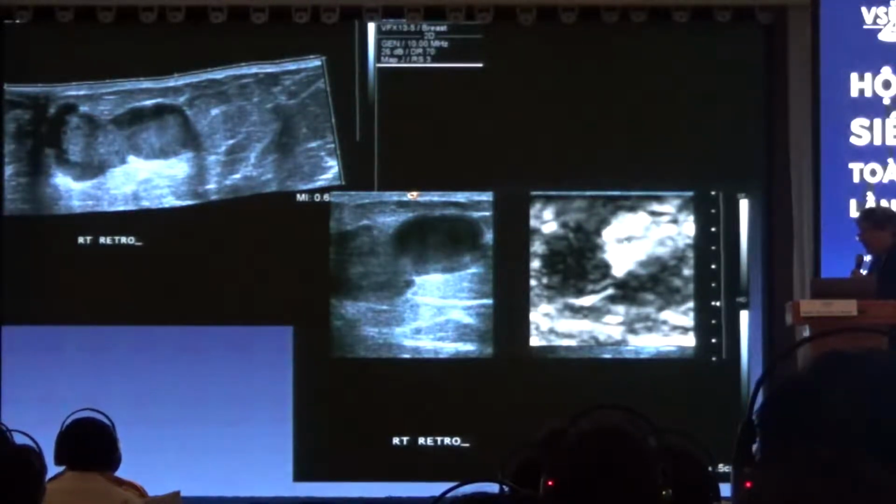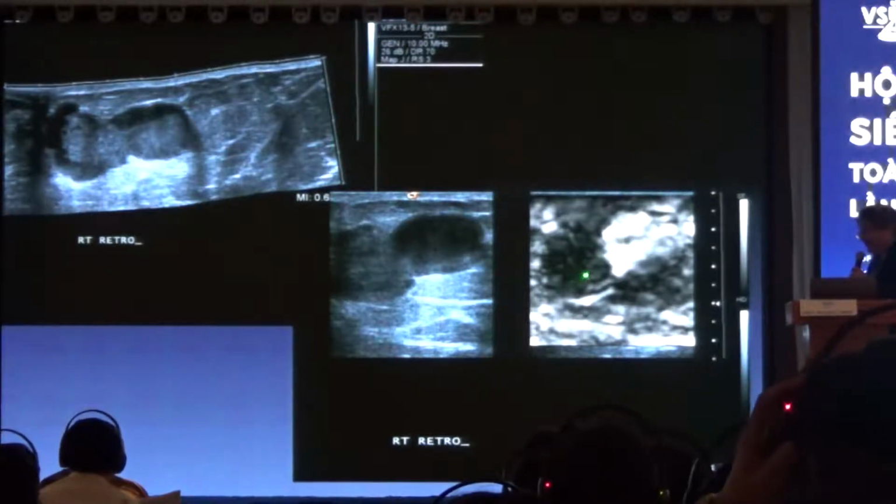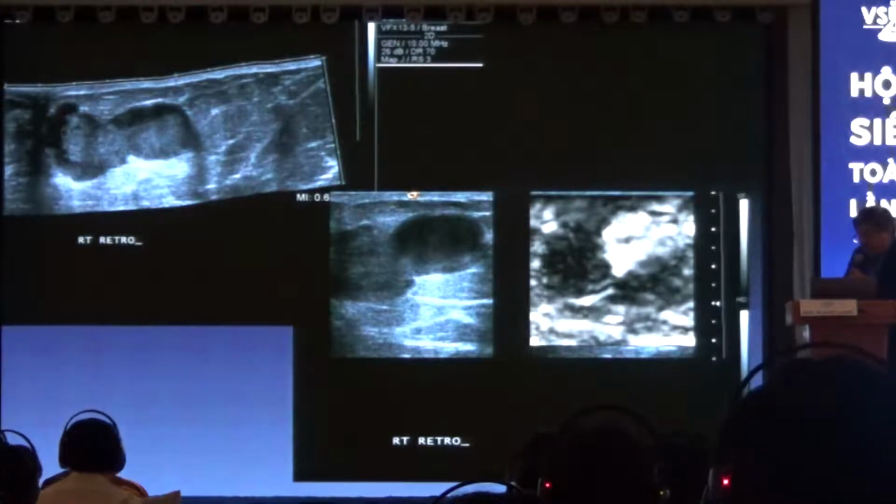old hematoma or old blood is very soft, so we thought this was actually blood, and we stuck a 20 gauge or an 18 gauge needle and aspirated this, and this was old blood. This stiff area, we did a core biopsy, and this was an invasive papillary cancer. So again, using elastography to decide how you're going to do your biopsy is very helpful.